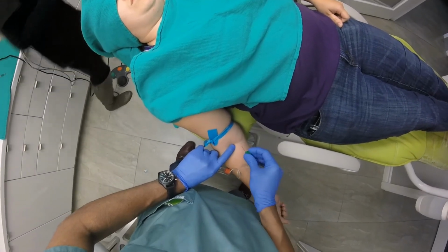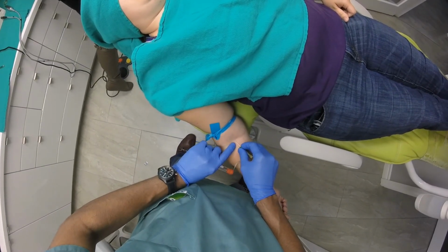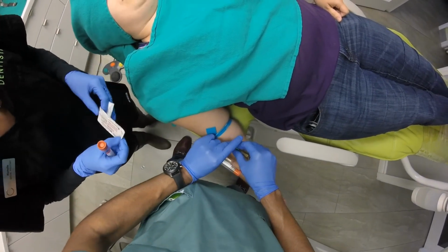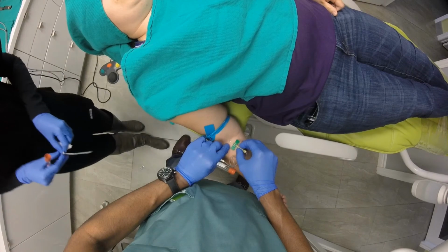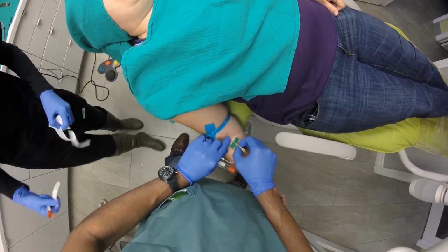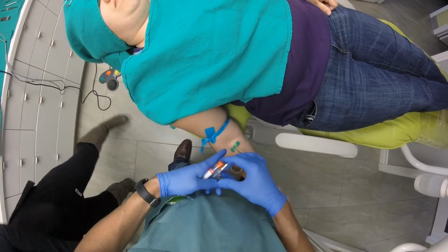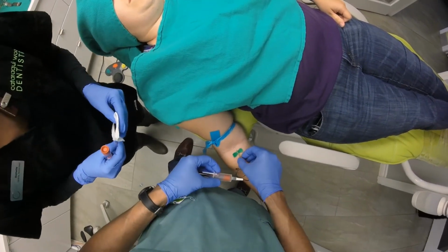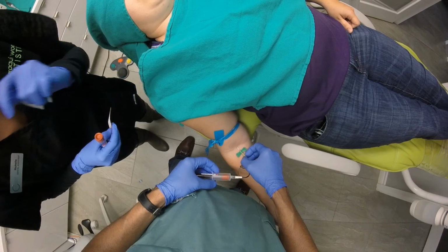So you can also see now I'm grabbing the alcohol sanitizer and just cleansing the skin for this patient, waiting a period of time, allowing the skin to dry, and basically feeling for that blood vessel. An old school nurse once told me that you should go for the vessel that you can feel, not the vessel you can see.